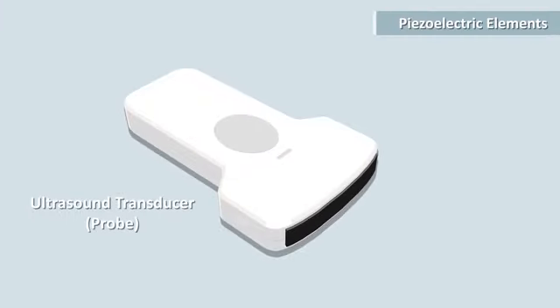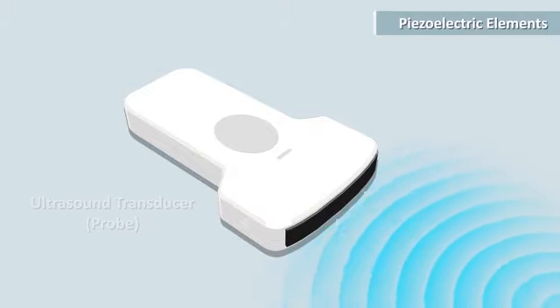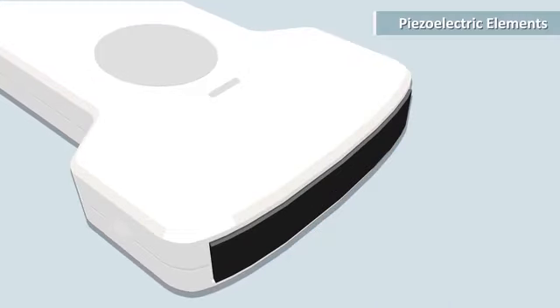the organs. Ultrasound is a series of tiny mechanical pressure waves propagating through the body. These sound waves are generated, transmitted, and received by an ultrasound transducer. Now, let's see how this works.